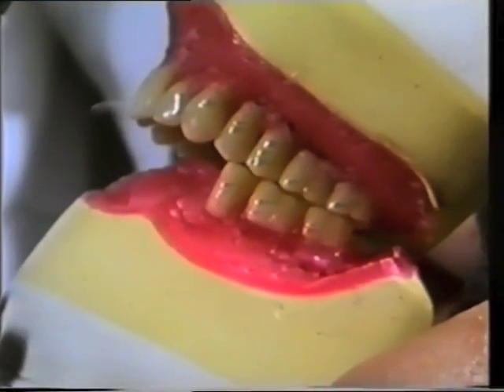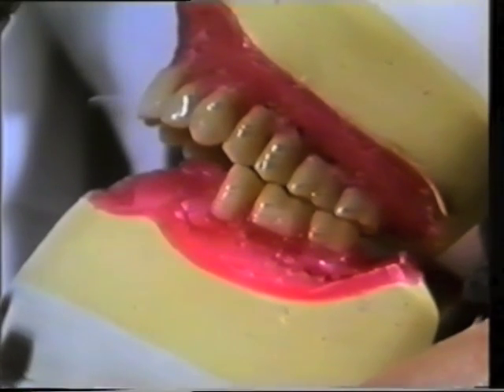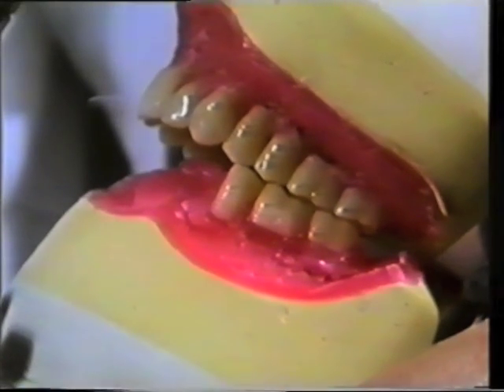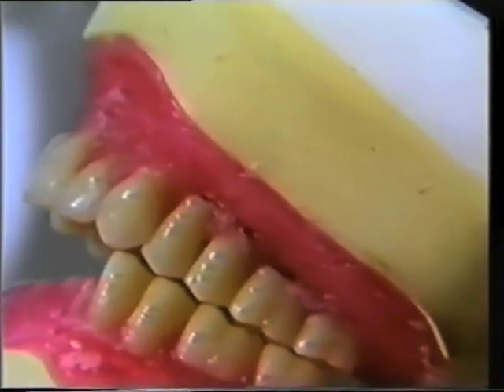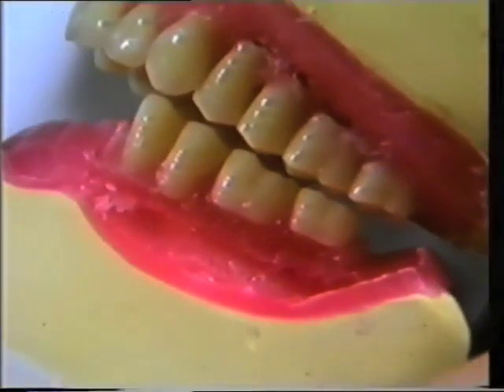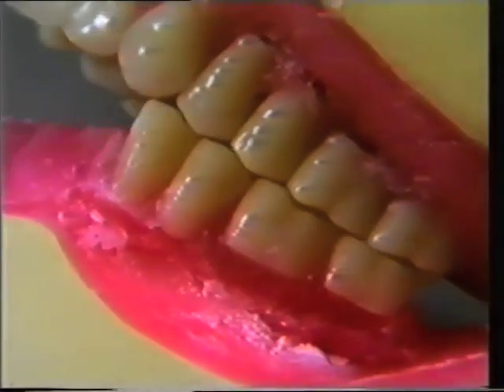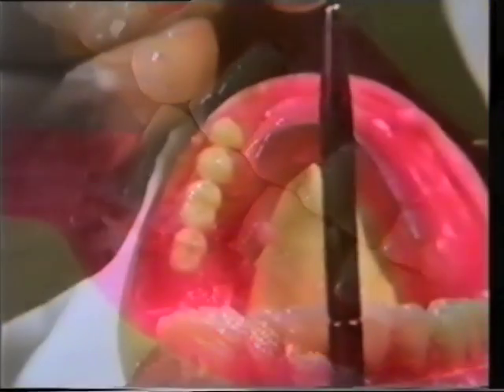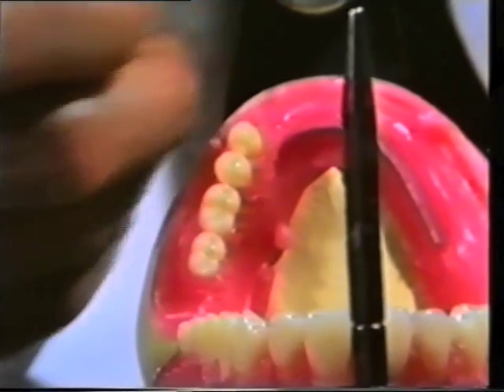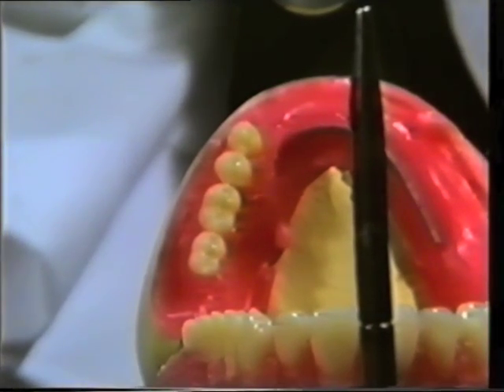The same procedure is followed when setting up the second mandibular molar, and finally the first premolar. Note also that the mandibular teeth are positioned in line over the center of the residual ridge.